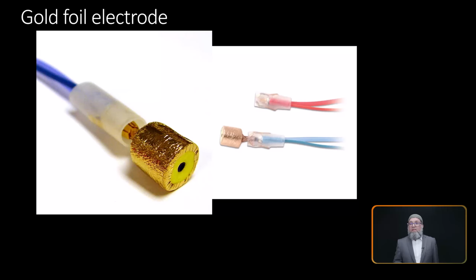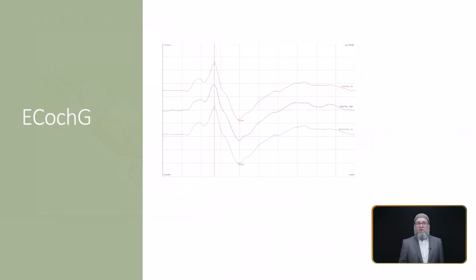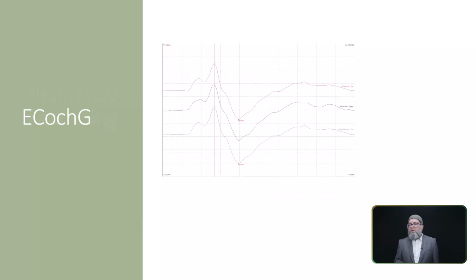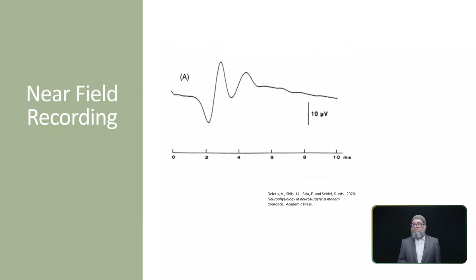The tubes again, this is not the only tube. It has the tube and the connection, the probe, the electrode, which is connected to the cable connected to the machine. But the gold foil tip is disposable, so the sound is used for stimulation and recording from the cochlea. This is how an electrocochleogram looks on the screen. We have the cochlear microphonic, summation potential, and N1, the largest component.